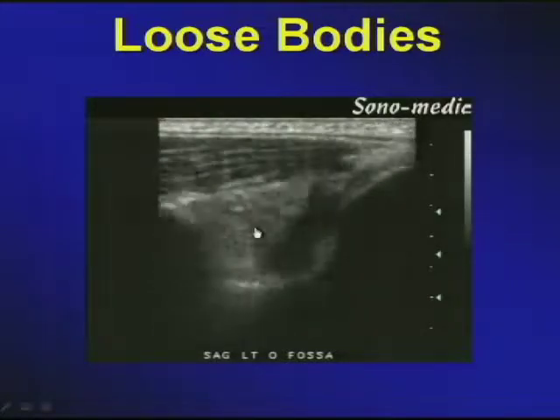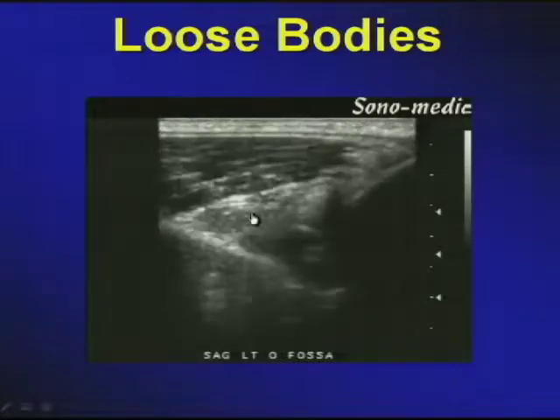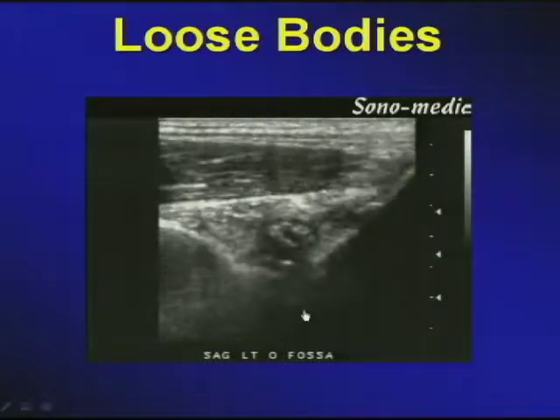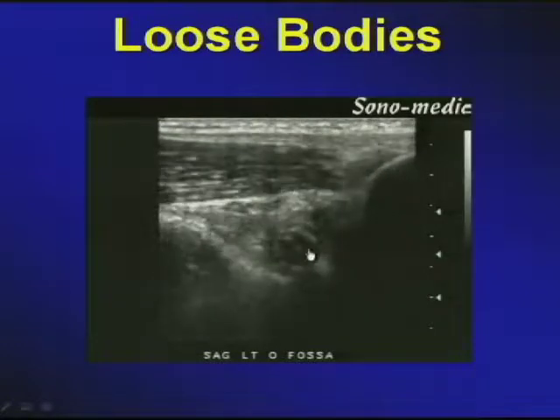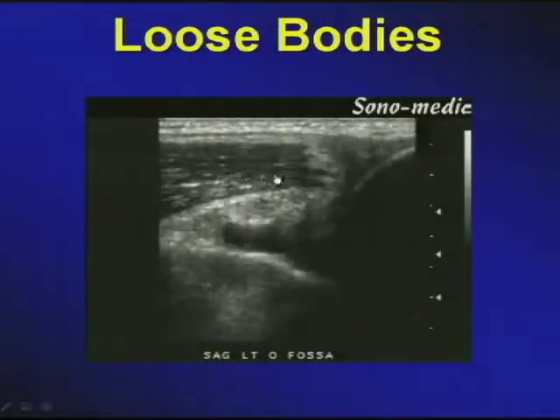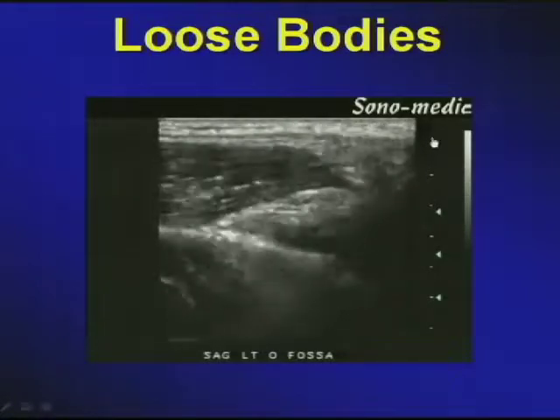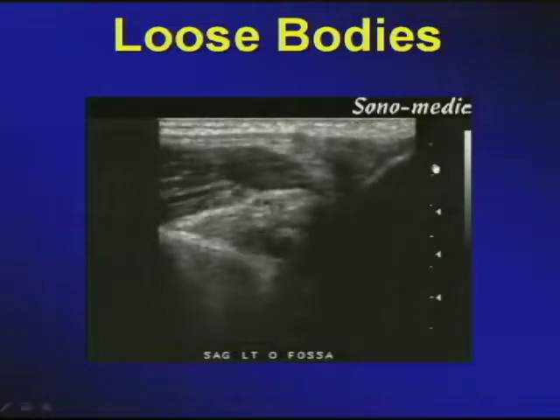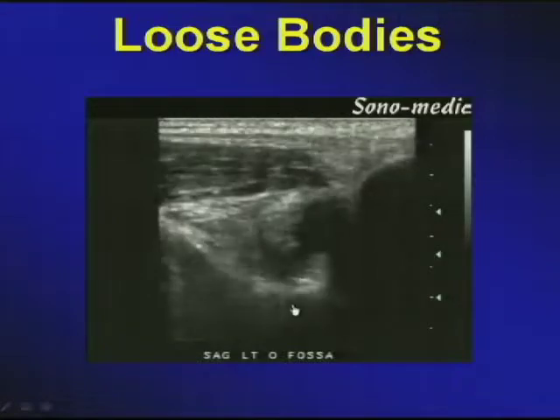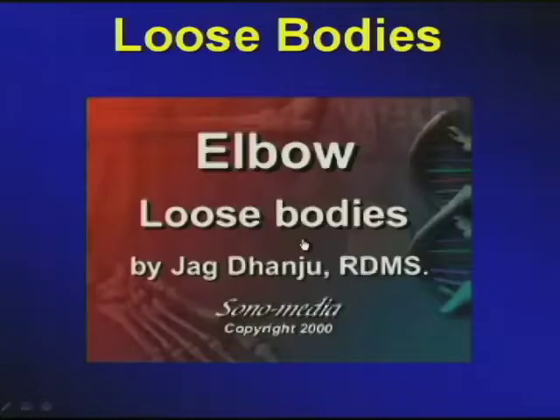Here again, with a minimally distended olecranon fossa with fluid, you see an elevated posterior fat pad sign, a high-level circular echo with posterior acoustic shadowing, indeed confirming that you have a loose body on long axis view. Long axis because you see the multi-pennate structure of the triceps muscle and the fibrillar pattern of the triceps tendon in the long axis view inserting on the olecranon fossa. And if you're looking at it on the long axis view with a little bit of compression, you again appreciate the bouncing up and down of this loose body.